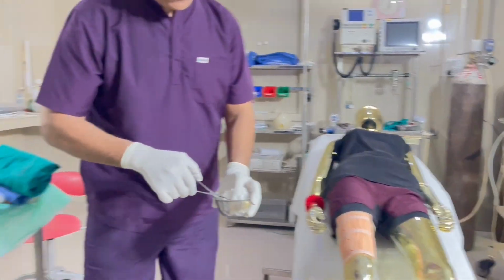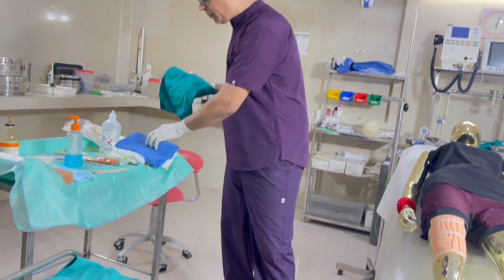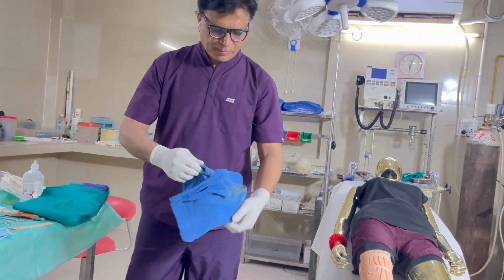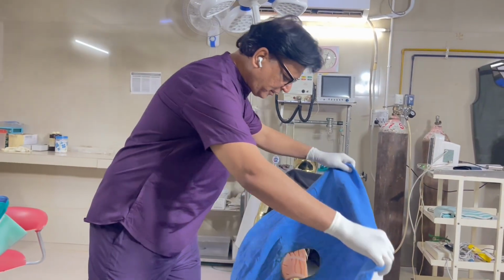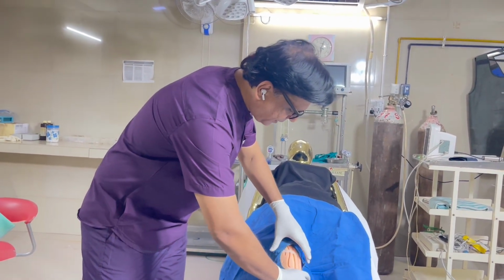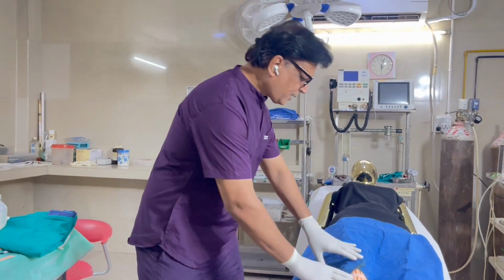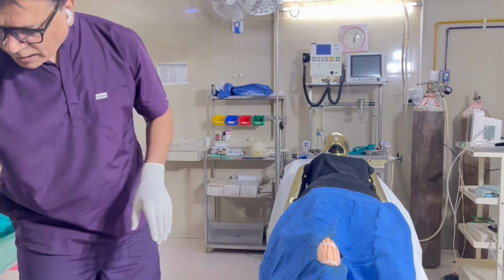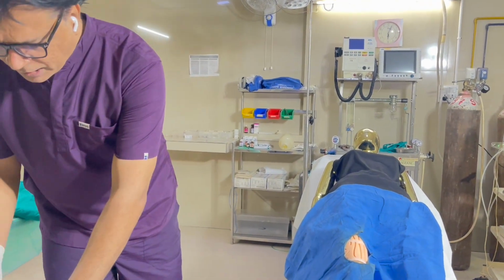So after cleaning it, so the drape, if it is available, I will be putting a sterile drape and cover the wound in this manner. So Miss Linda, this is covered. So now the wound is clean, and then I will be giving one injection which is a numbing agent.